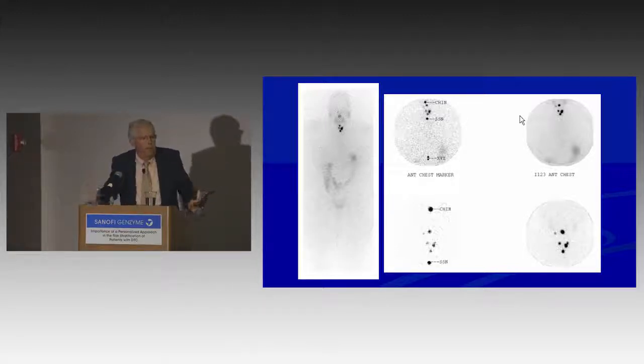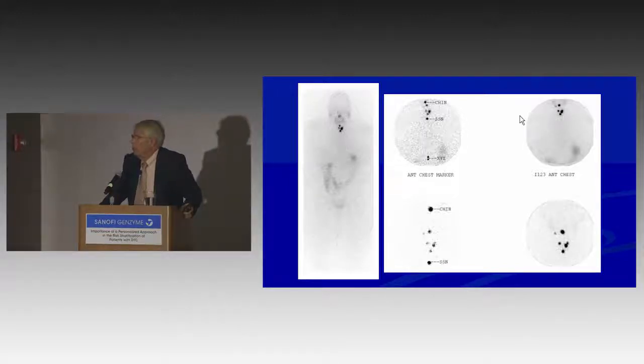thyroid bed. And so the conclusion or interpretation would typically be most likely normal residual thyroid tissue that any good surgeon might leave behind. Chest is negative, abdomen, there's some activity in the GI tract and possibly some activity in the lower GI tract or bladder.